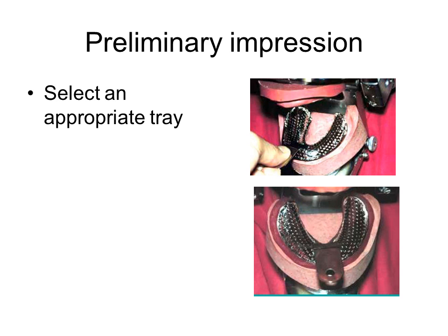Red rope wax may be added to conform the borders of the tray to the mouth and to confine the impression material, and to correct underextensions of the tray. The tray is rotated into the mouth and tried in prior to making the impression. Flanges of the tray may be adjusted to allow a better fit. Plastic trays may be warmed. Metal trays may be adjusted by bending.